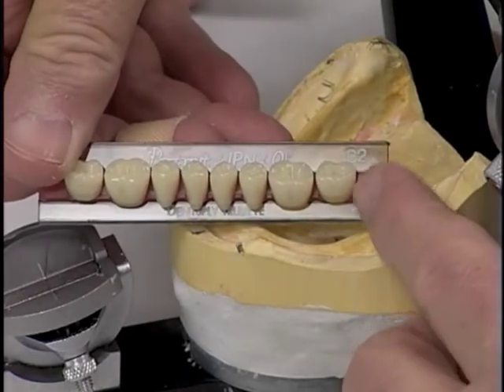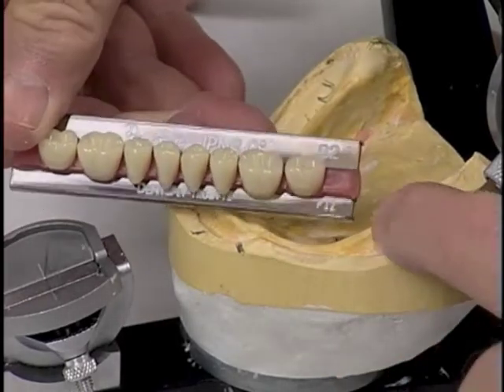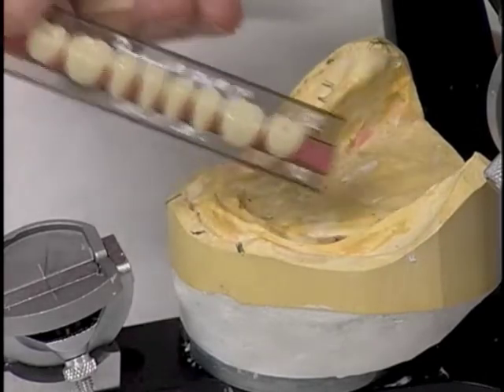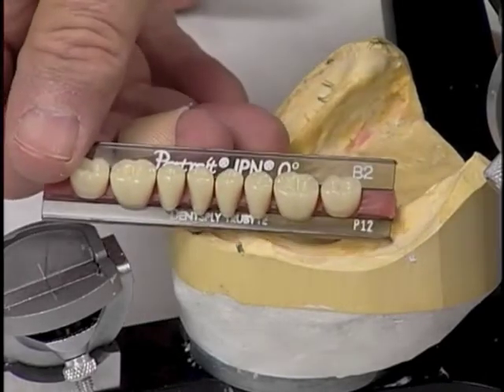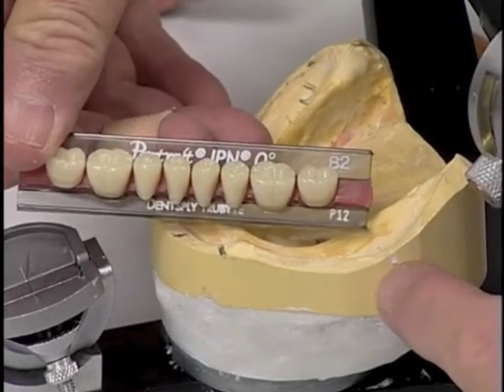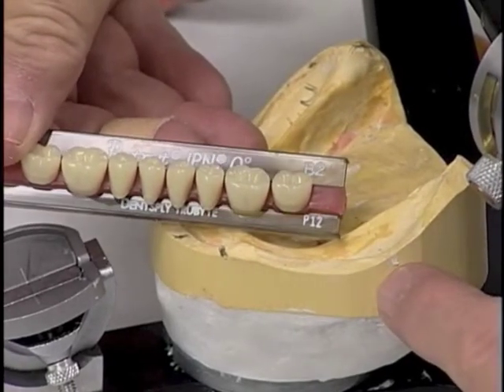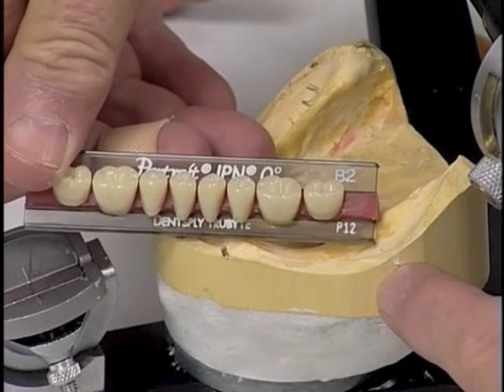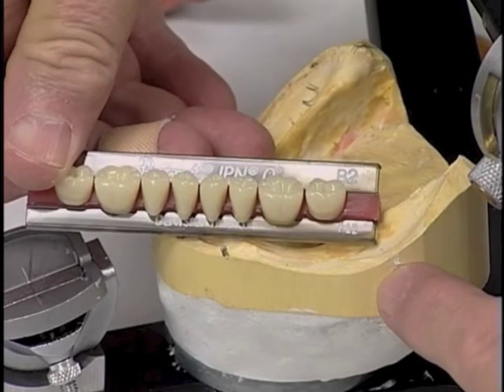We can see the distal of the second molar now is about here, which is slightly on the uprise of this ridge. But this being such a resorbed ridge, we would somewhat expect that, yes, we couldn't stop occlusion all the way up there. We wouldn't have anything to occlude with. But reasonably, we could put one premolar and two molars in.